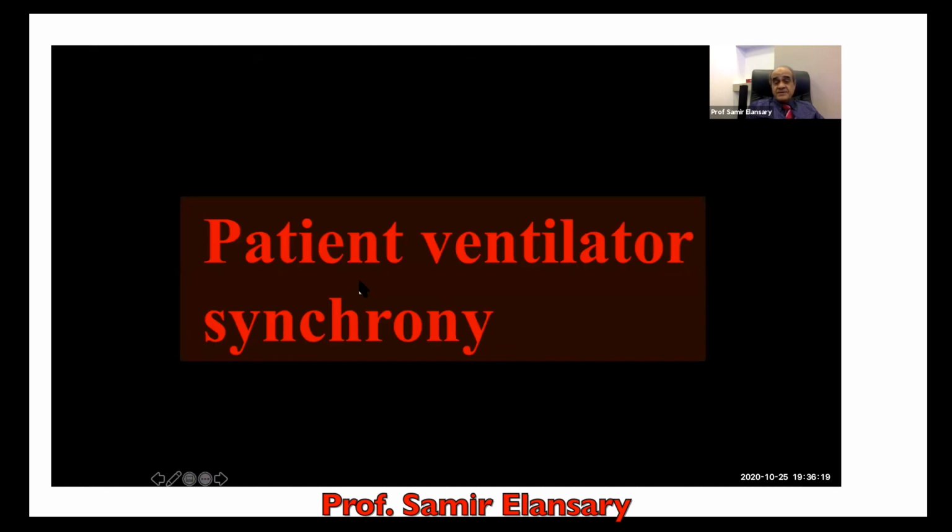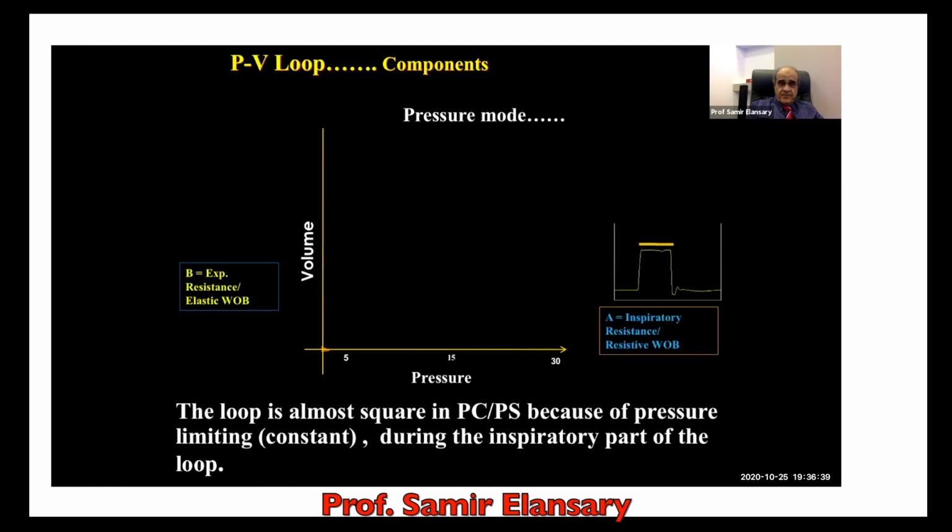Patient ventilator synchrony is very important, and so try to optimize the airway flow to avoid stacking of breaths. Also adjust the triggering effort, which must be optimal for the patient, good sedation, and so on. Synchrony improves oxygenation and decreases the ventilator days.